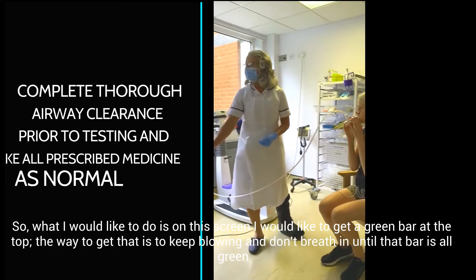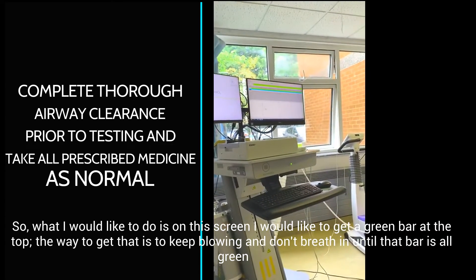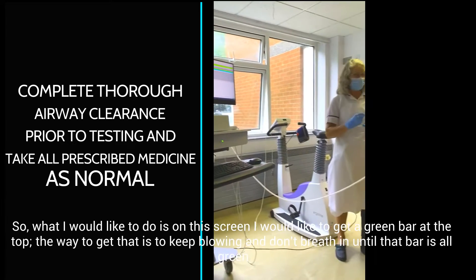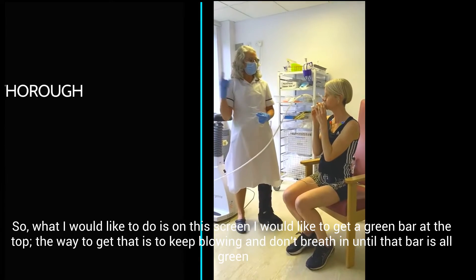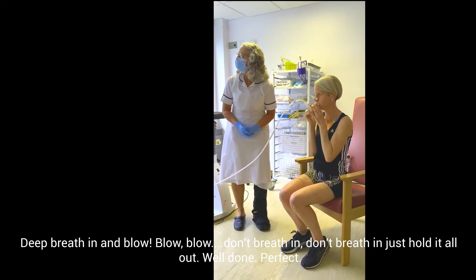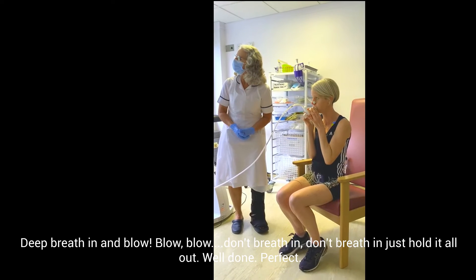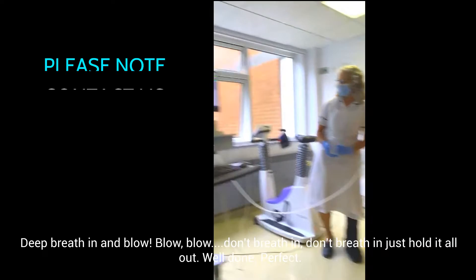So what I'd like to do is, on this screen, I'd like to get a green bar at the top. The way you get that is to keep blowing and don't breathe in until that line goes green. And blow, blow, blow. Just keep blowing. Don't breathe in — it's all out. Well done, well done.